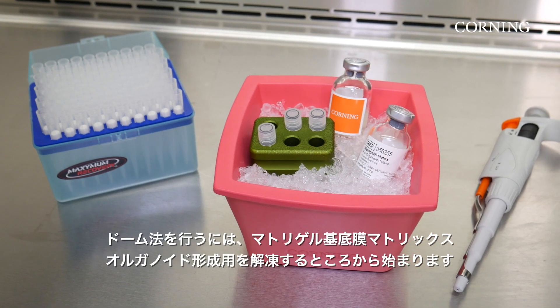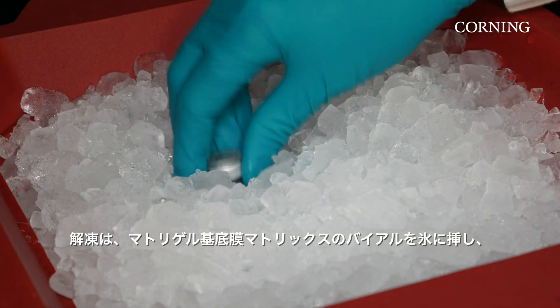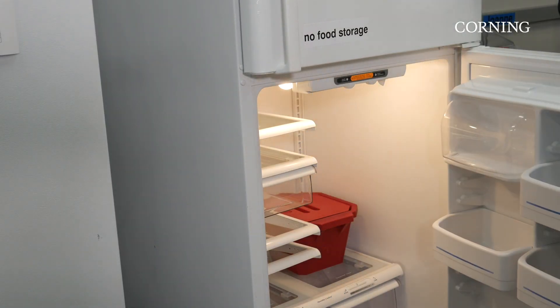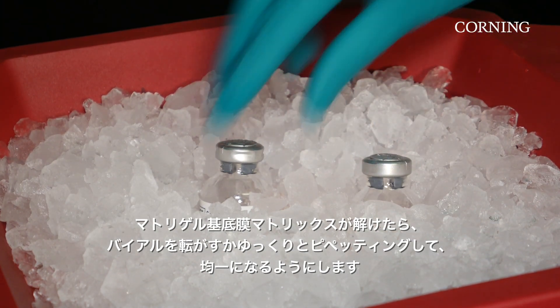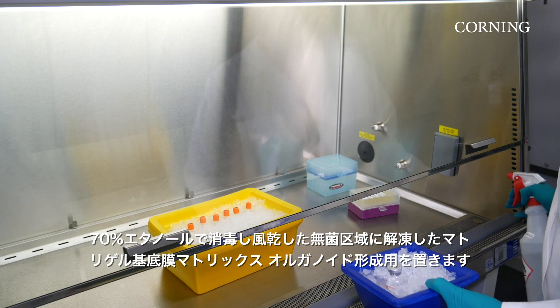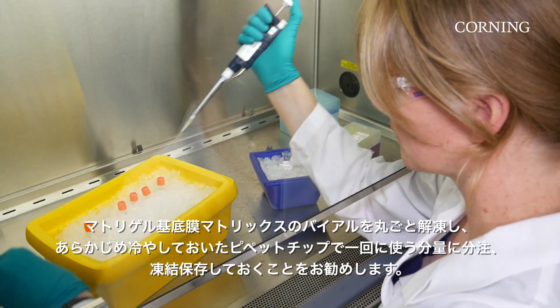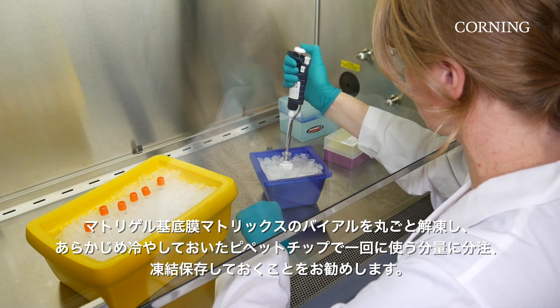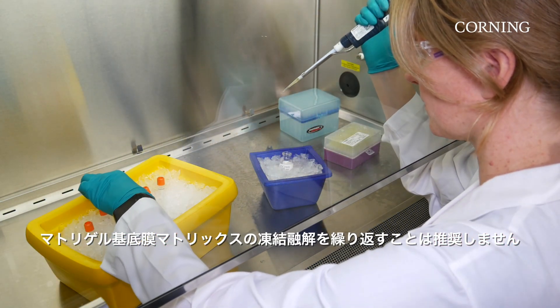To perform the dome method, begin by thawing Matrigel Matrix for organoid culture. To thaw, submerge the vials of Matrigel Matrix in ice in a 4 degrees Celsius refrigerator in the back overnight. Once thawed, swirl the vial or pipette up and down to ensure the material is evenly dispersed. Place thawed Matrigel Matrix in a sterile area sprayed with 70% ethanol and air dried. It is best to thaw the entire vial and aliquot its contents using pre-cooled pipette tips into single-use portions stored frozen until use. Repeatedly thawing Matrigel Matrix is not recommended.